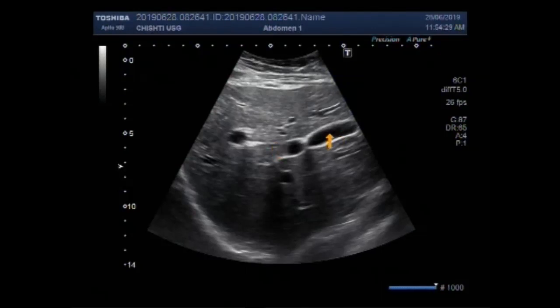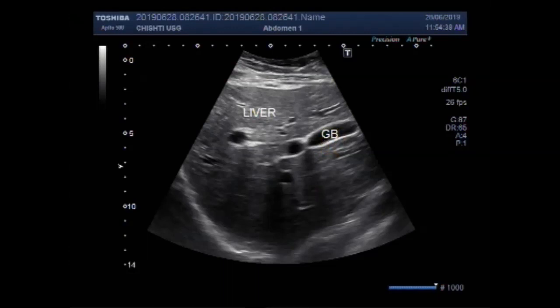Dear viewers, I hope you are all fine. This ultrasound video shows a stone in the bile duct. You can see the liver and gallbladder.